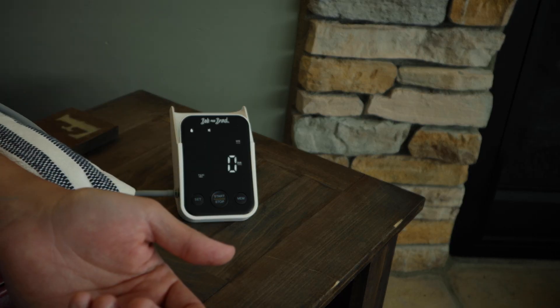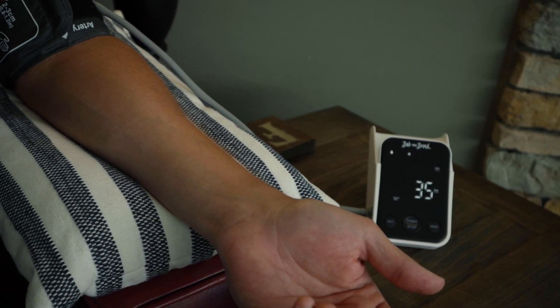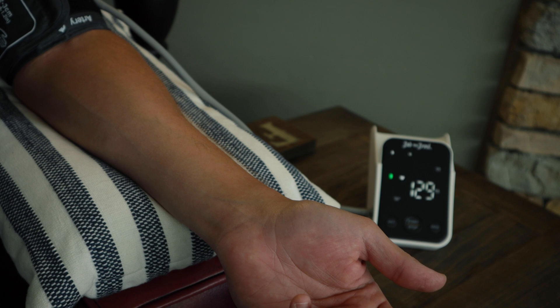Once you're ready to take your blood pressure, you simply press the start button and you'll start to feel the machine inflate around your arm. It's normal to feel like it's squeezing your arm pretty tight, so don't be alarmed by that. It'll reach its peak pressure, start to deflate, and then provide a reading to you on the screen.